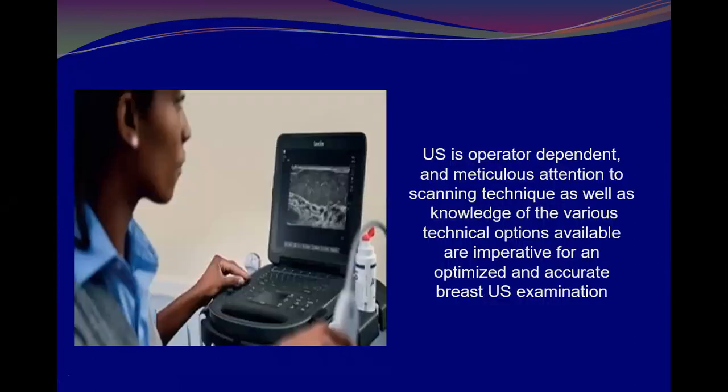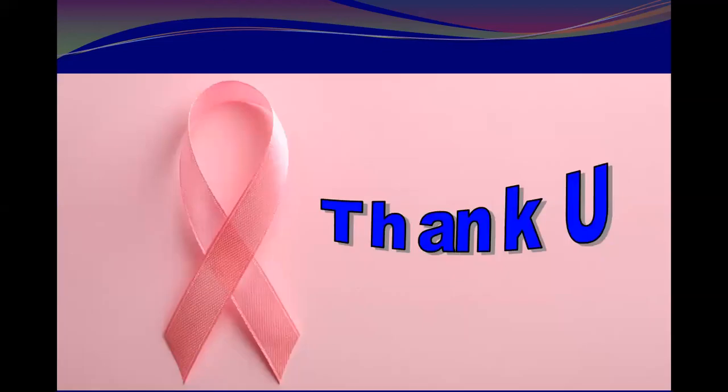At the end, we can say ultrasound is operator dependent, and meticulous attention to scanning technique as well as knowledge of the various technical options available are imperative for an optimized and accurate breast ultrasound examination. And thank you. Any questions?